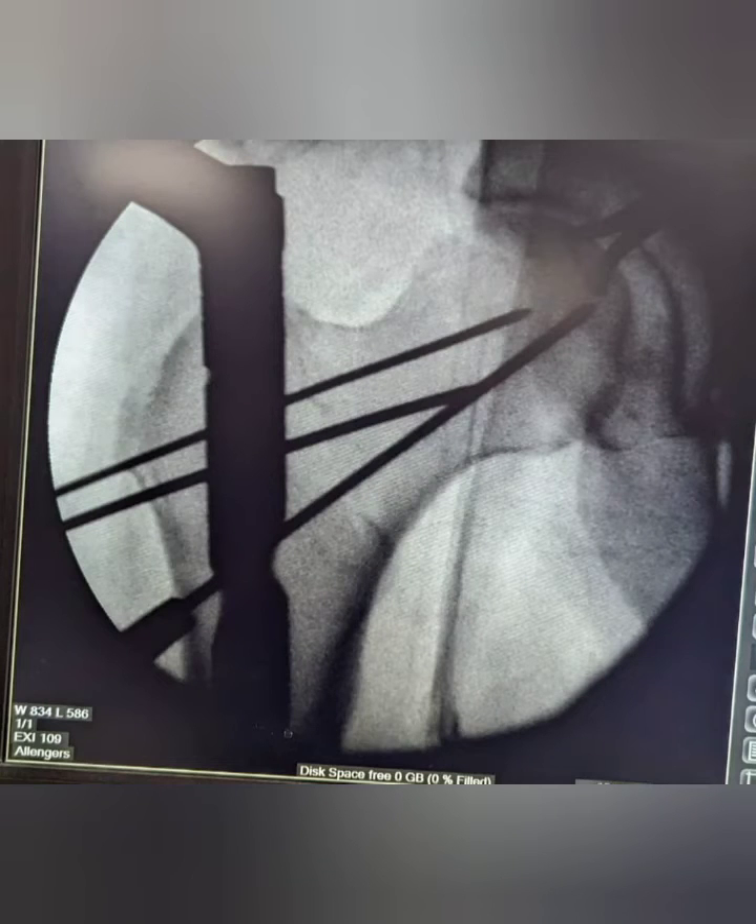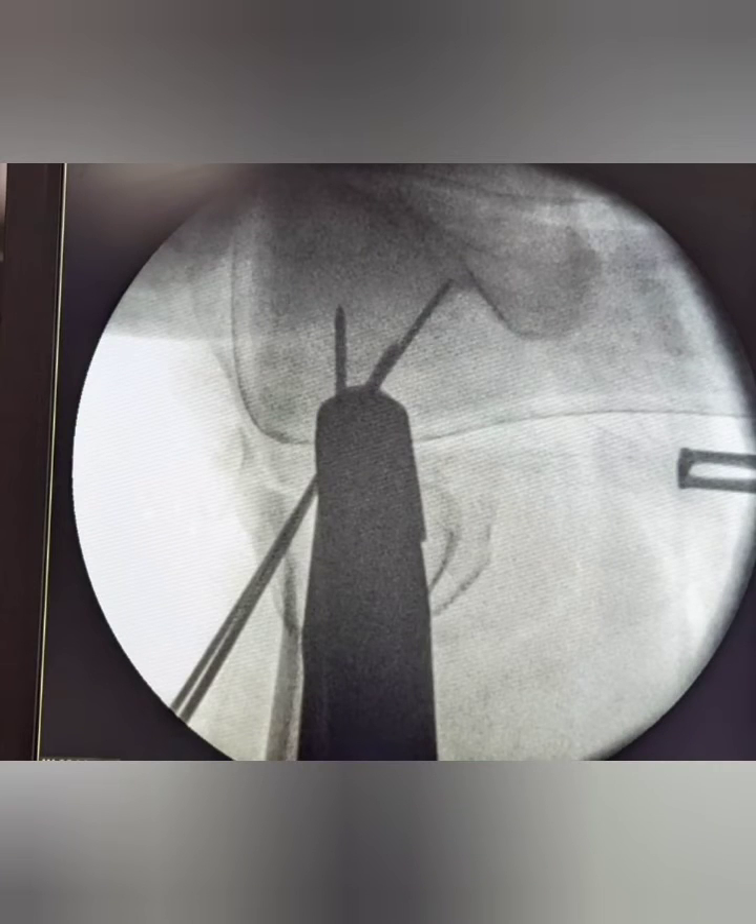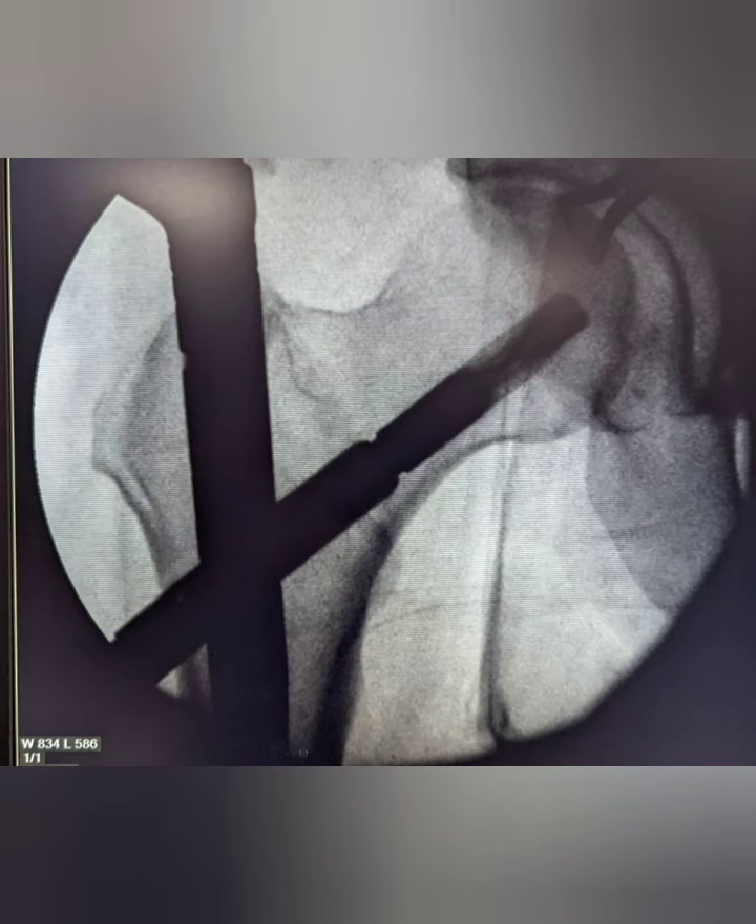To pass the helical blade, we pass a guide wire through the jig and confirm it on AP and lateral radiograph. The helical blade is then hammered over the guide wire.